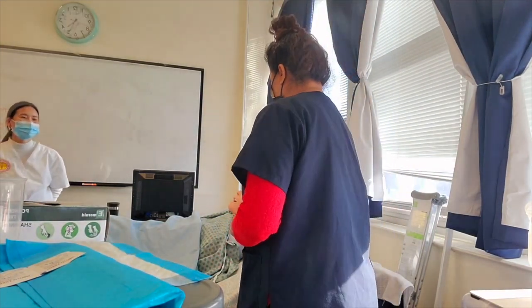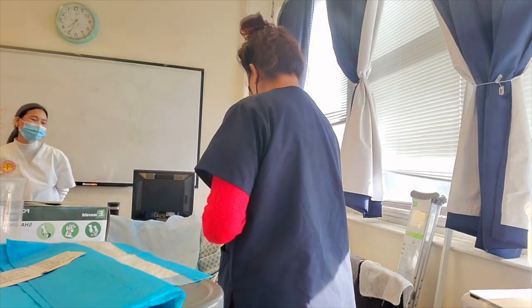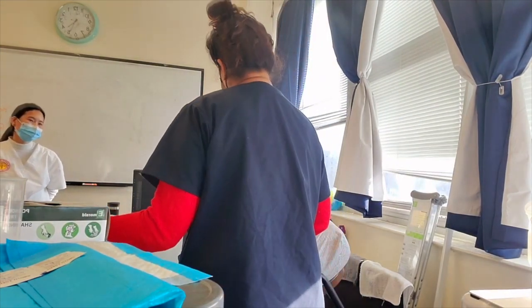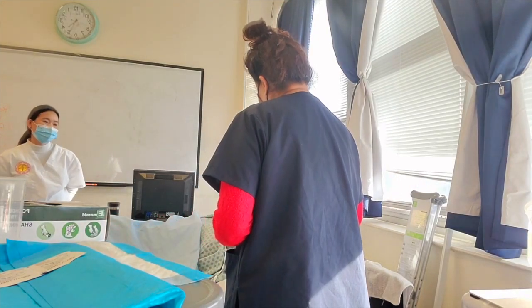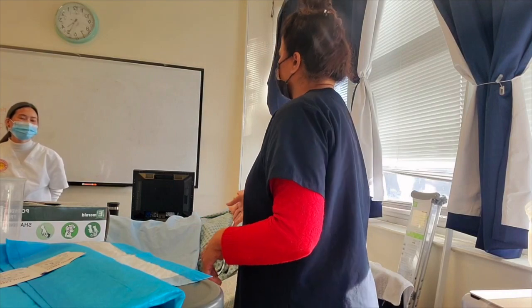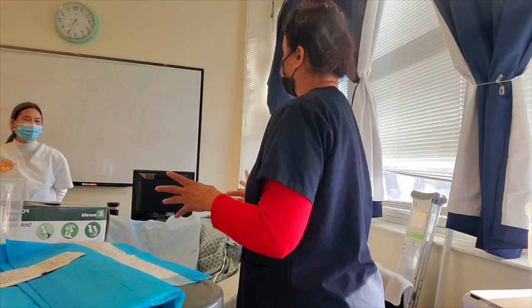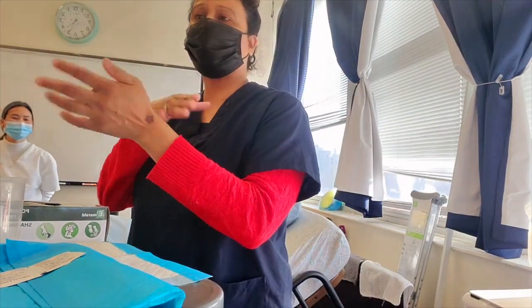Hello, good afternoon. My name is — I'm going to be your nurse today. I'm here to measure your output from your Foley catheter. Is that okay with you? Okay, I'll be right back — I'm going to go wash my hands and gather my equipment.